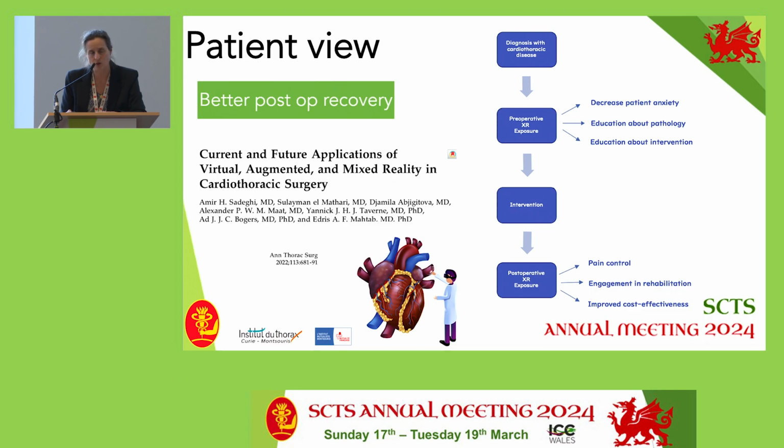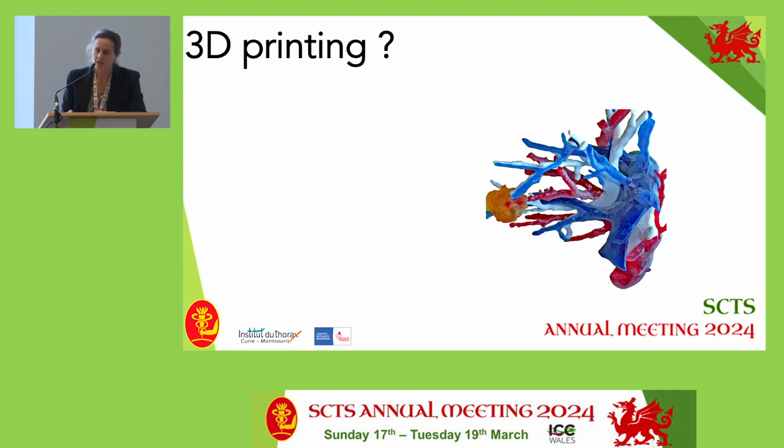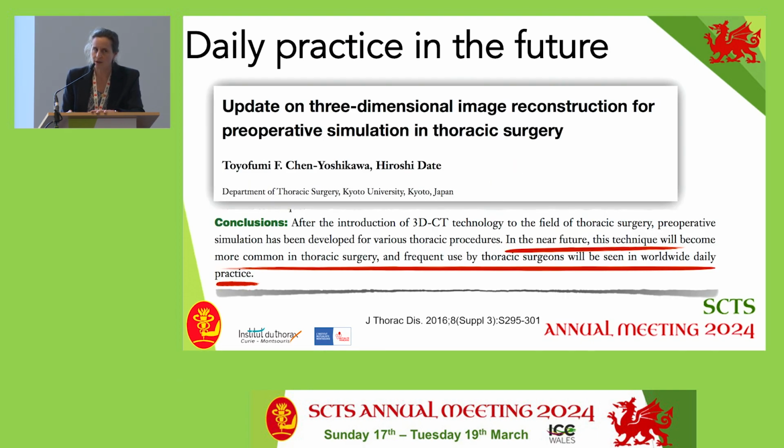How can I afford that models in my hospital? So I like these publications where the little thing at the end is that they prove that you have a cost effectiveness if you use the 3D models. Do we need a 3D printing? Sometimes I feel better. I'm not sure of that. I just think that for some cases, complex mediastinal tumor, for education or even for the surgeon, it could be helpful, but not for all patients. So we are not doing it in a daily routine activity. But what we are quite sure is that probably using this technique will be the daily practice for all thoracic surgeons.